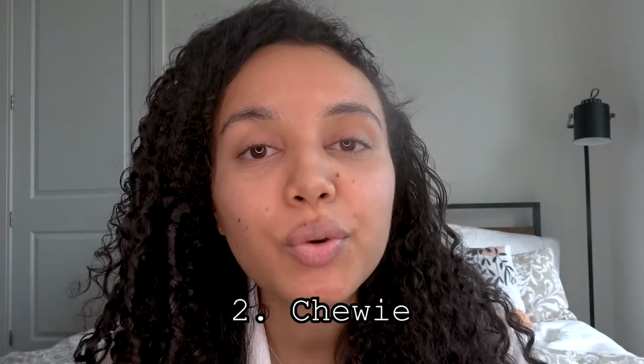Tip number 2, use your Chewies. They're not only helpful for helping to push your new tray into your teeth, they're also very soothing. It's very massaging. You know how babies, when they're teething, they like to chew on stuff? Well, my friends, we are like babies.